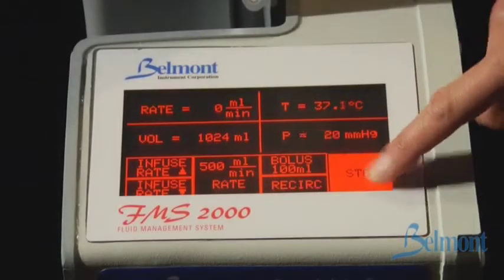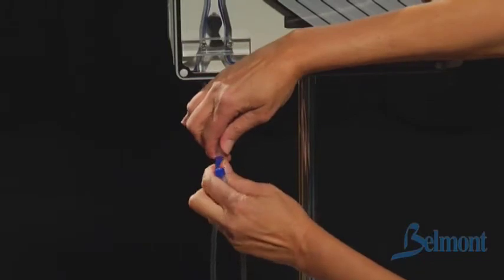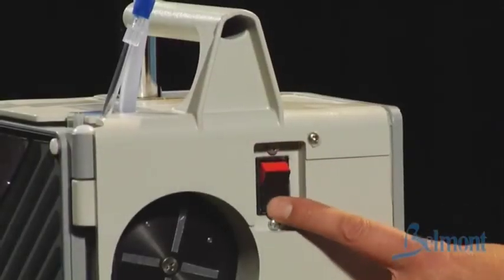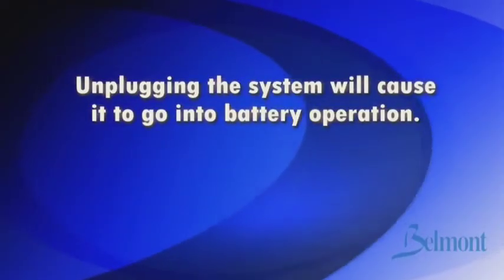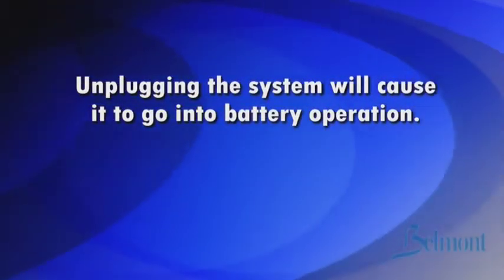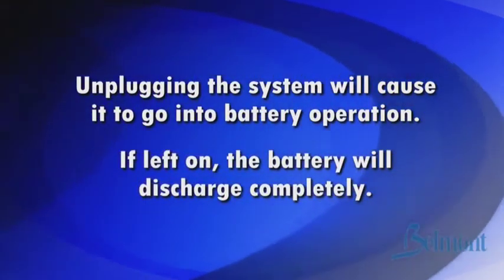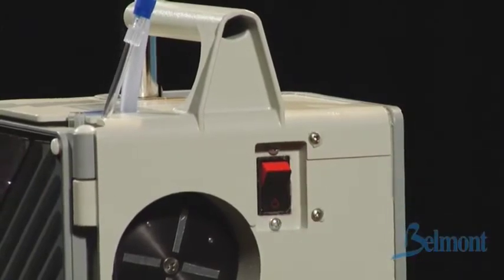Press stop to stop the pump at any time. At the end of the procedure, make sure to disconnect from the patient and power down by turning off the power switch, not by unplugging the system from the power source. Unplugging the system will cause it to go into battery operation and if left on, the battery will discharge completely. If this does happen, just turn the switch off, plug the unit in, and wait 30 seconds before powering up again.